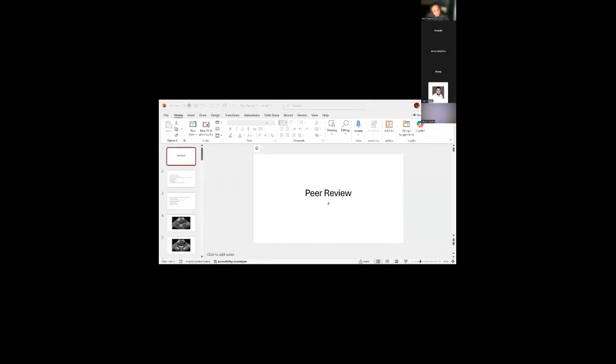Is there time just to present a quick one? Yeah, please. We're only doing peer review today.